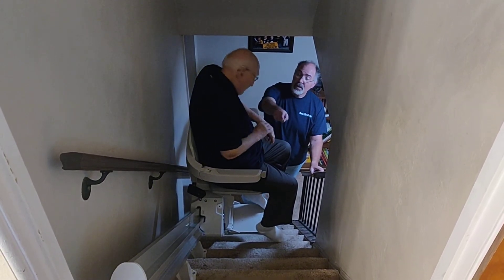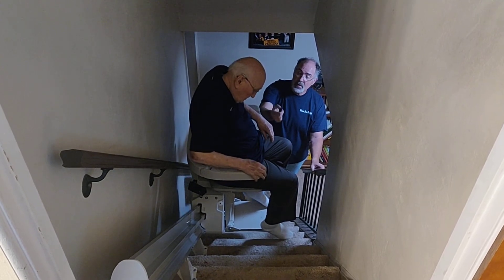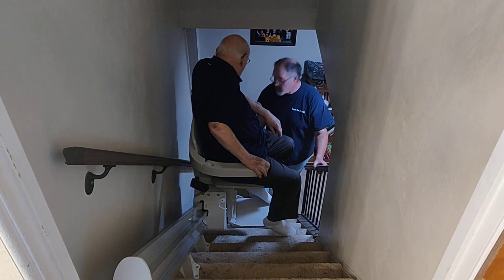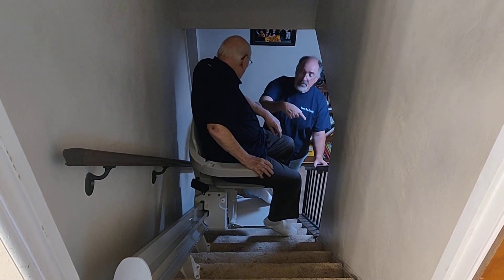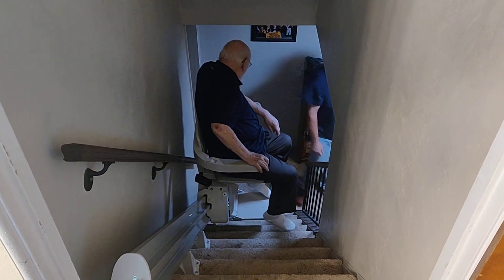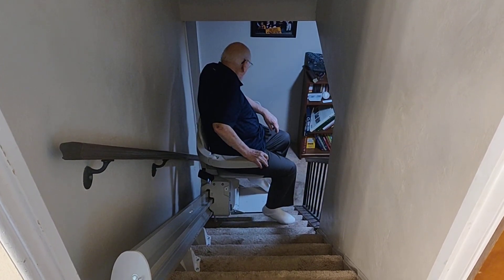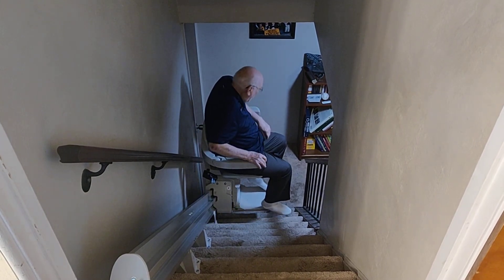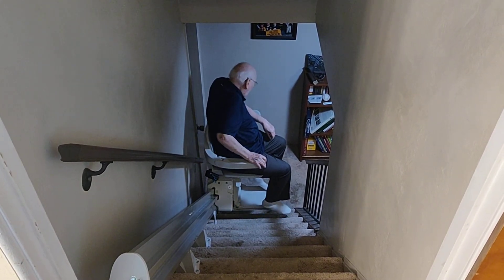Now hit that again towards me. See what you're doing? Oh, okay. Let go. Hit it again, same way. So after that rail goes down, you're coming down. Then I can go past where the rail is.